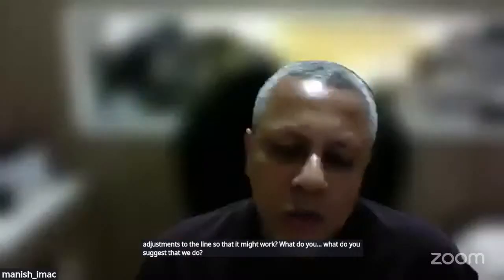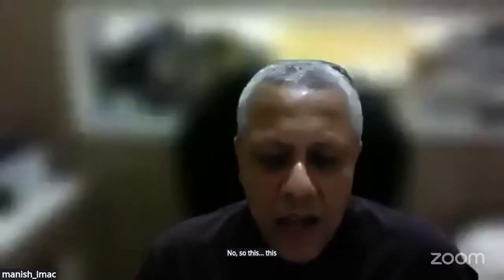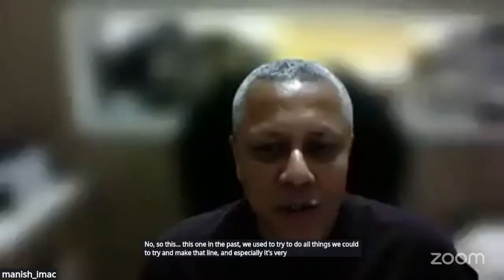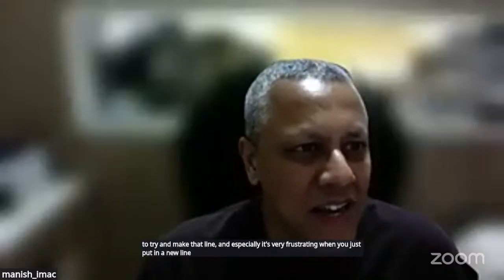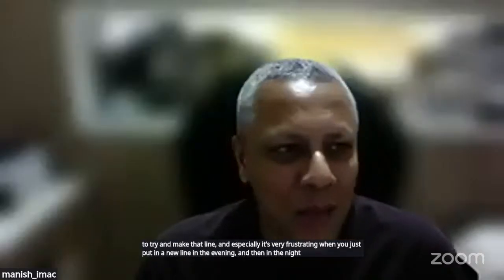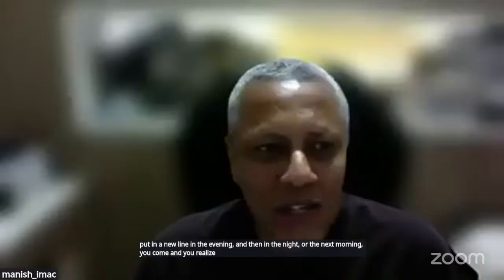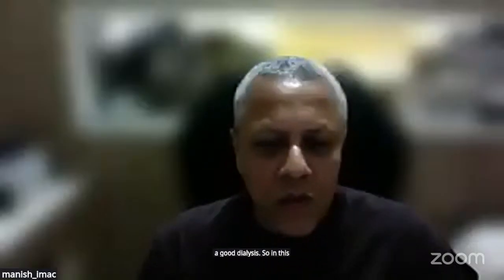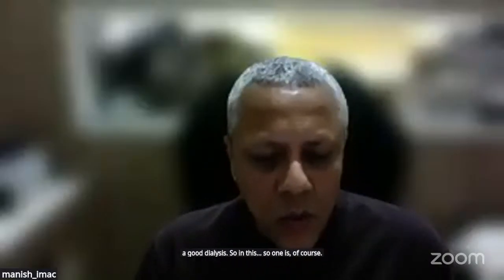No, so this one in the past, we used to try to do all things we could to try and make that line work. And especially it's very frustrating when you just put in a new line in the evening, and then in the night or the next morning you come and you realize 2 filters have gone just because the line didn't work or didn't get a good dialysis. So there are 2 or 3 things we will ensure.